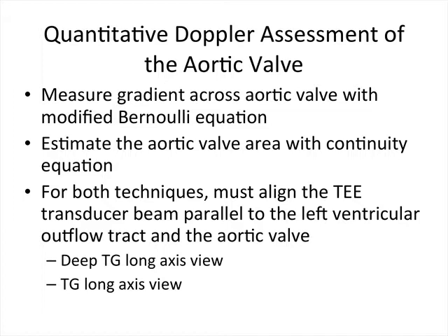equation. For both of these techniques, it is vital to align the TEE transducer beam parallel to the flow of blood through the left ventricular outflow tract and aortic valve. Otherwise, the angle of incidence will introduce significant error into the measurement.